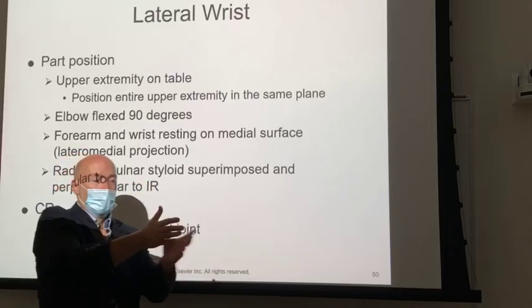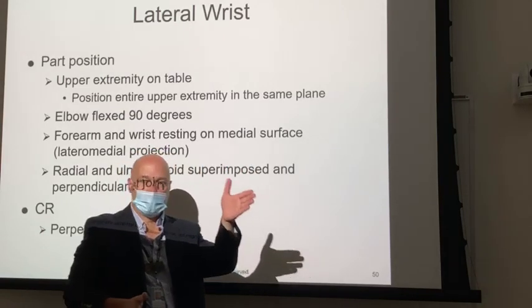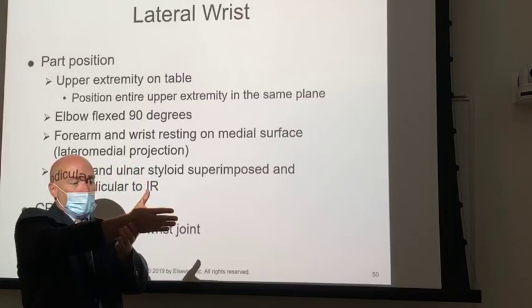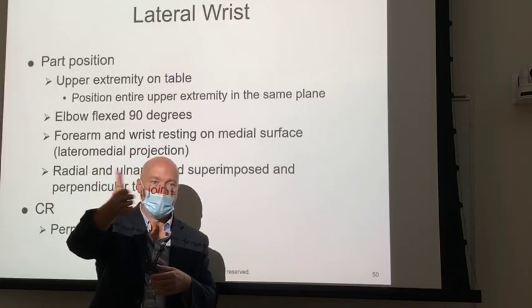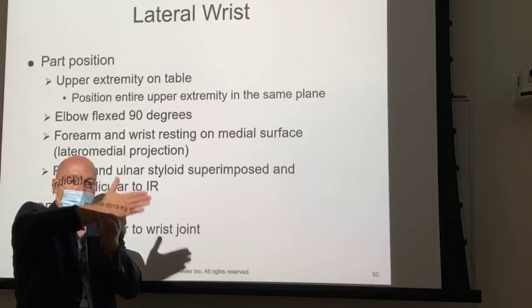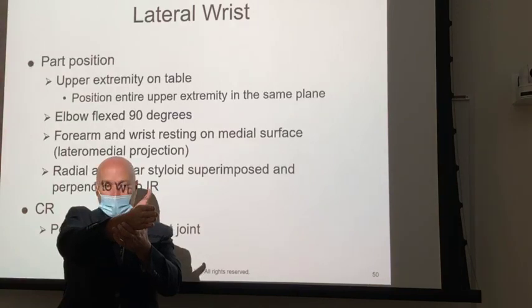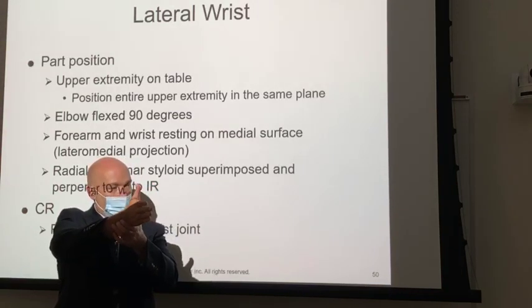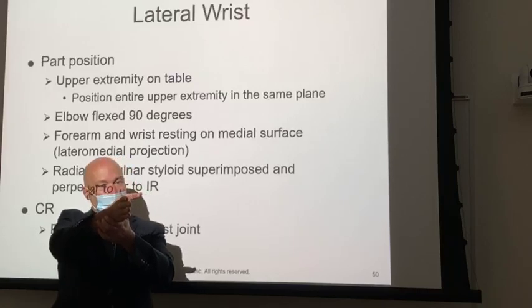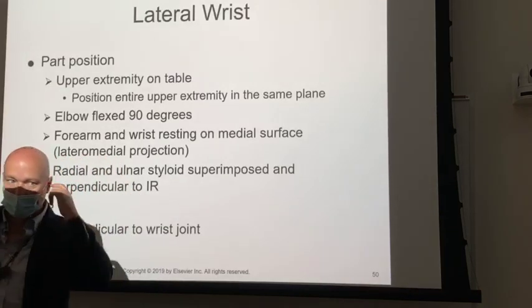So what you're going to have to do is use the carpal bones and the metacarpal bones to judge whether or not the hand is vertical, right? But what you need to do in a lot of patients is slightly supinate the hand so that you get the hand vertical, and then from vertical, what would be a lateral of the hand, you need to supinate the hand maybe 5 degrees. So it's from here to maybe here. Very slight, very subtle supination, okay?